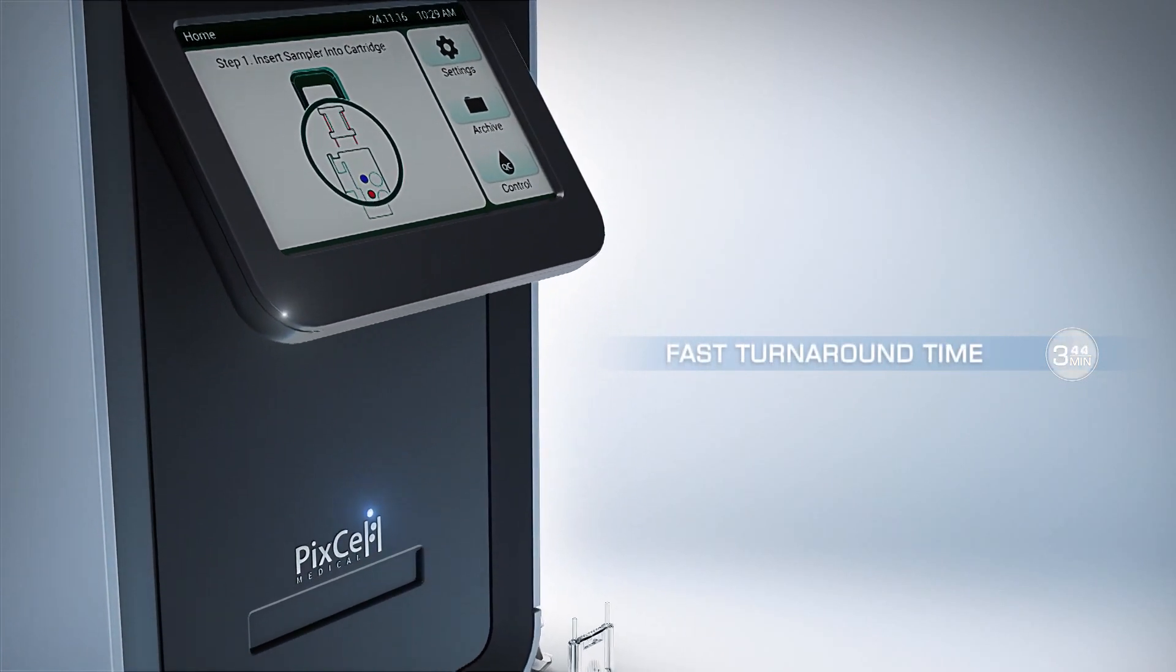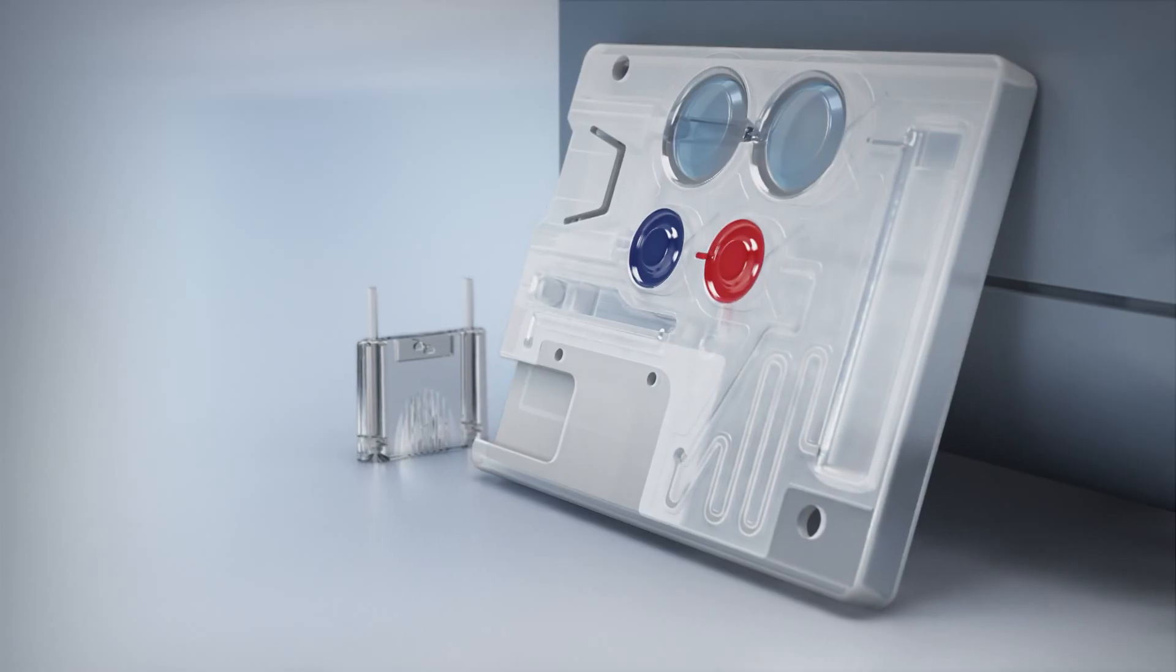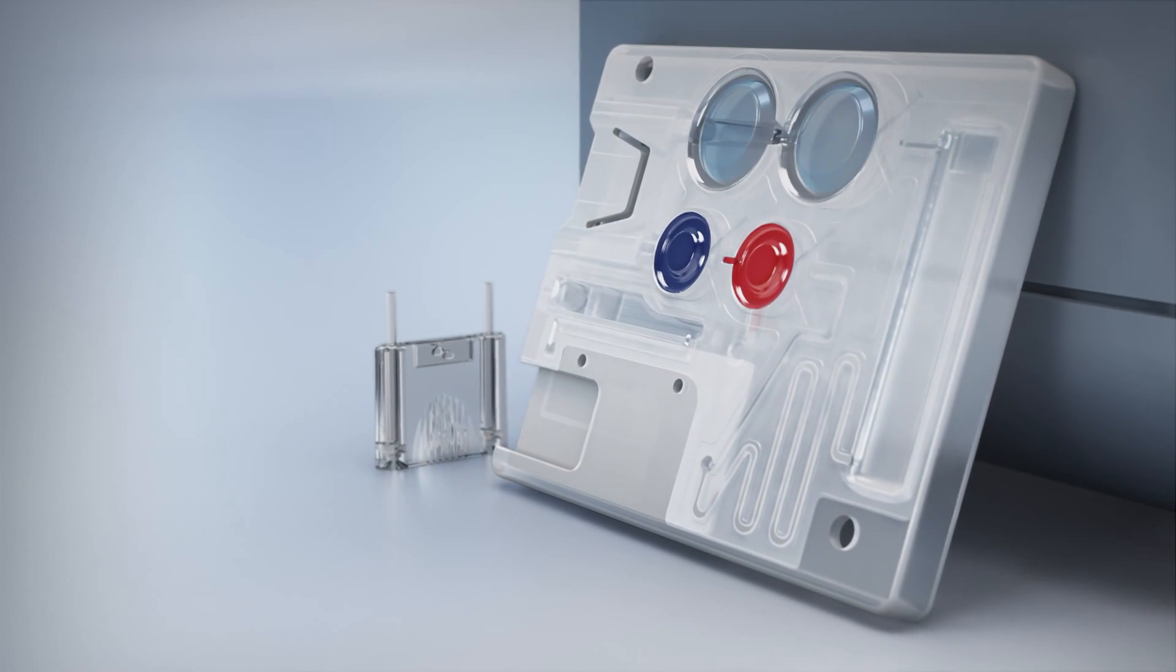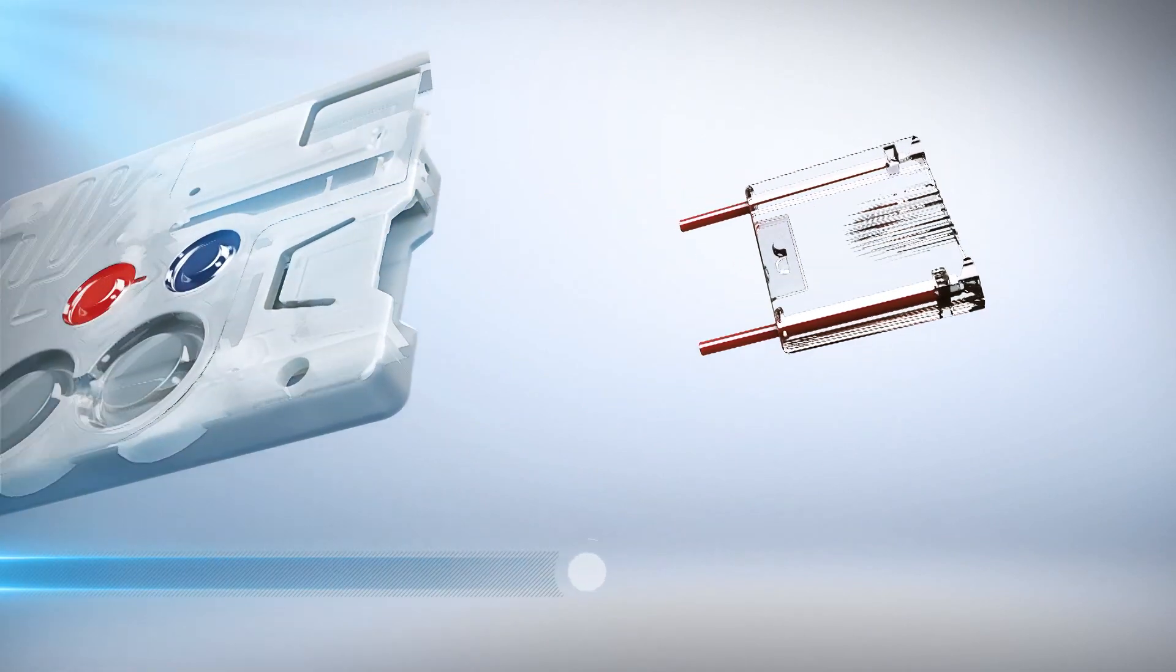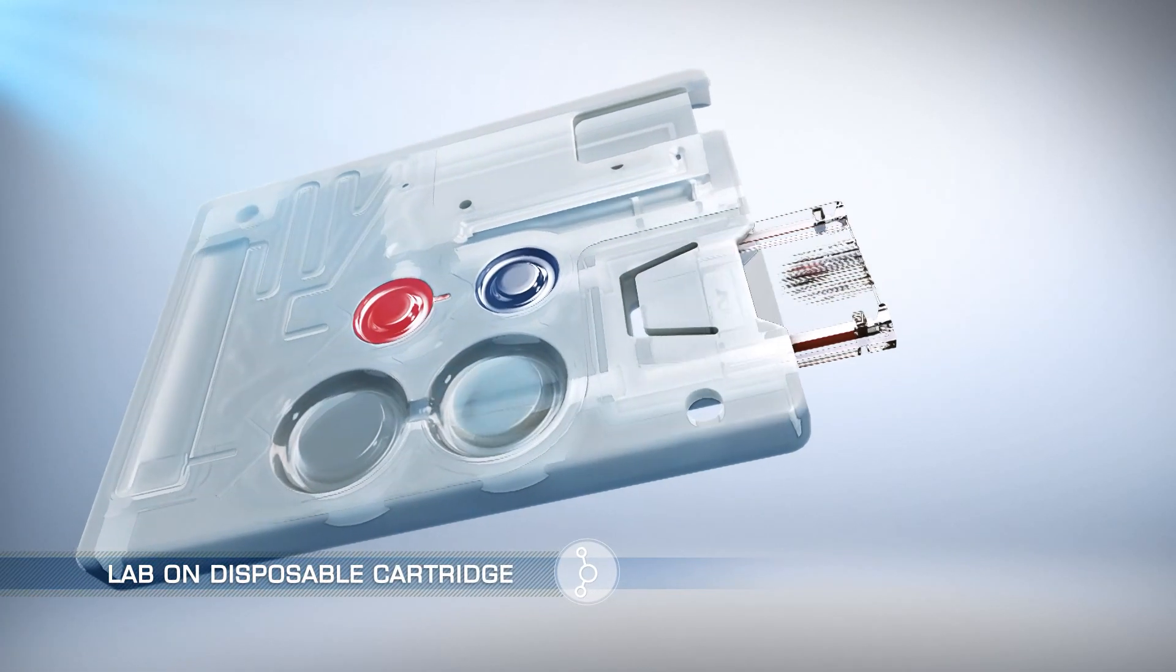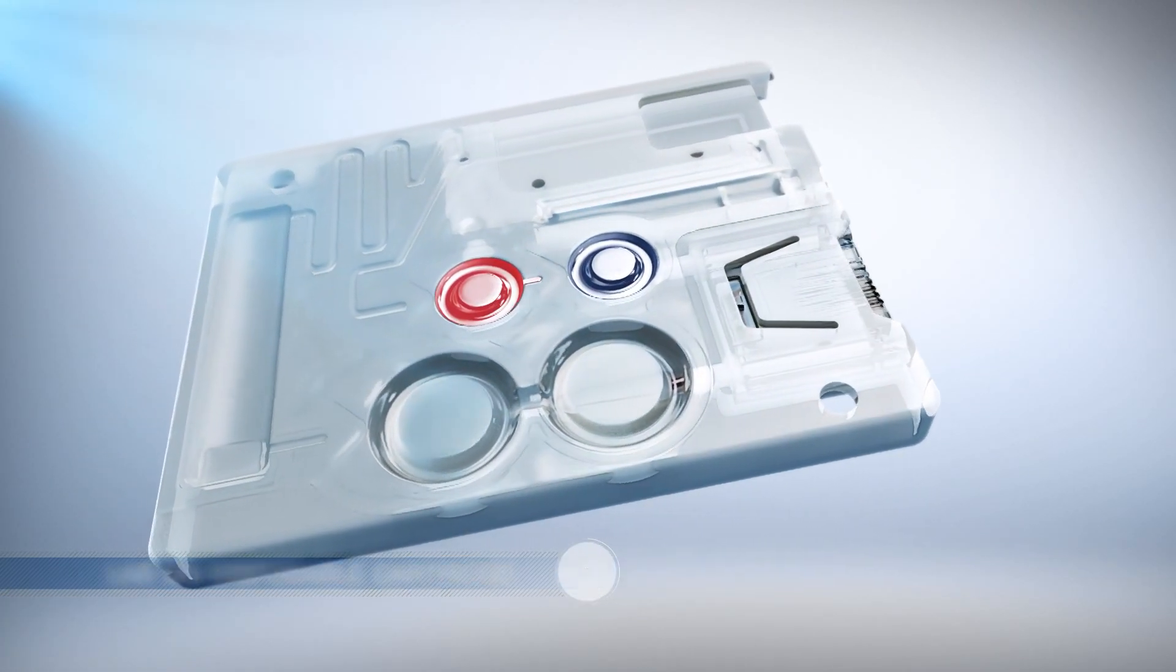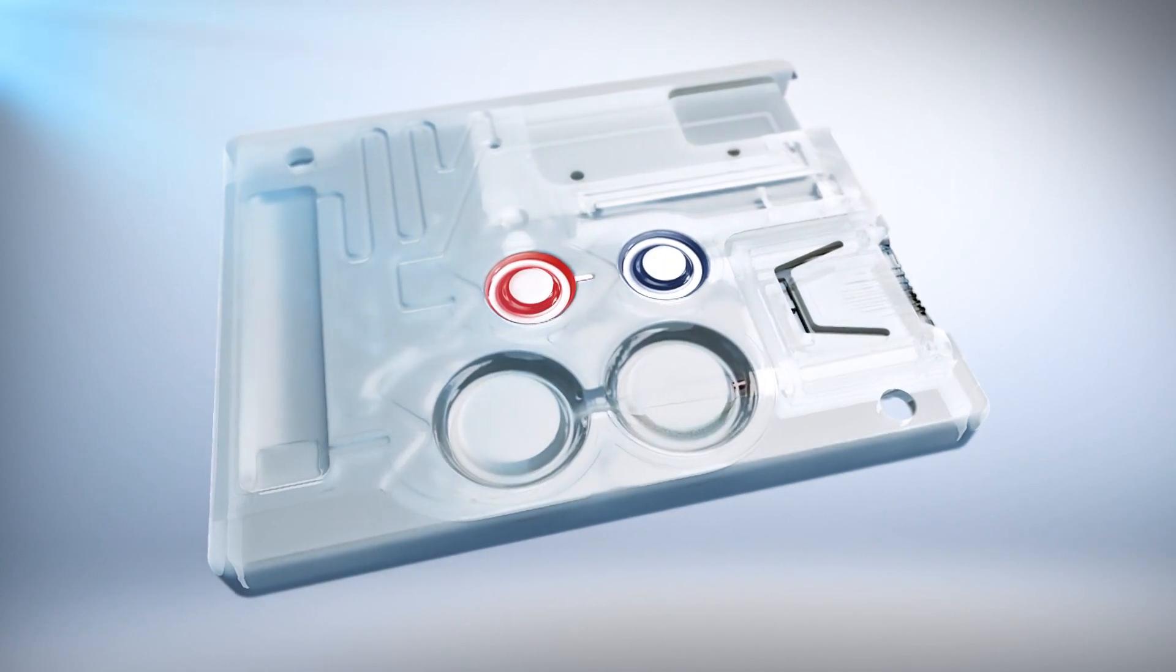Hemoscreen reader provides immediate results within five minutes, designed specifically to save time and operating costs. The reader uses a disposable cartridge ensuring ease of use and preventing any cross contamination. No calibration or maintenance is required.